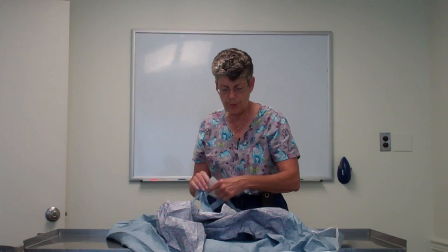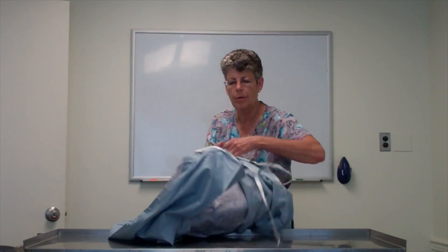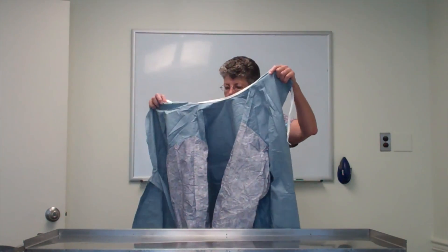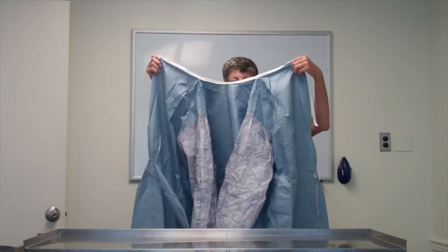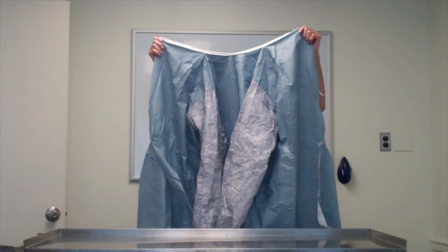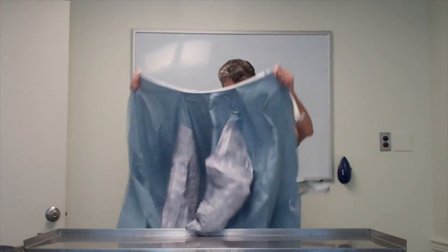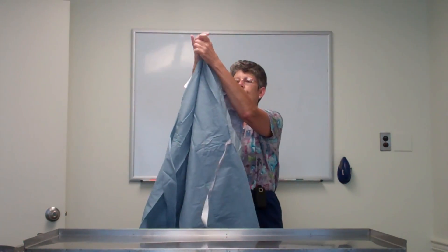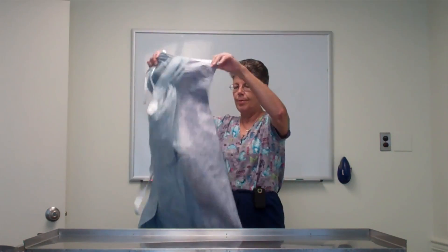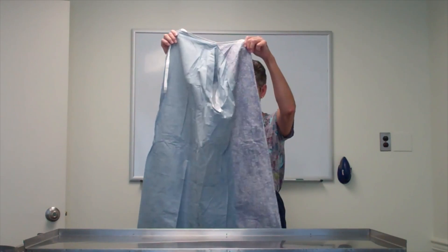Okay, again now to refold this properly, these arms have to be outside of that tie — like this. At this point, you're holding the top of the gown and you shake everything down. You're going to fold the gown in half, working at the top — the inside middle of the gown. So you're going to fold the gown inside out.